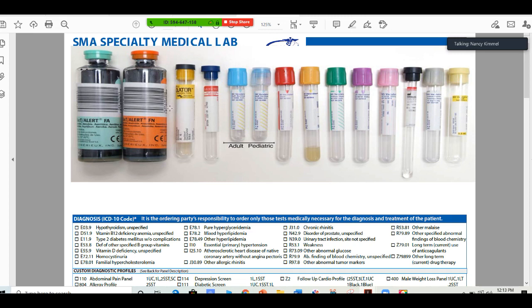Order of draw: blood cultures will always be first. This is also a different type of blood culture — you see the little yellow tube, the yellow cover here? And this one at the end is also an acid citrate dextrose blood culture.